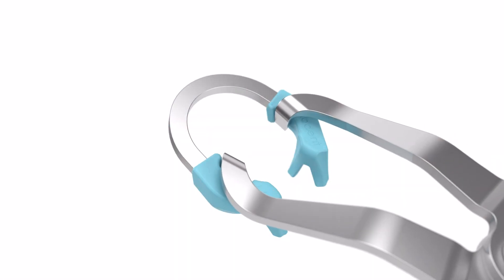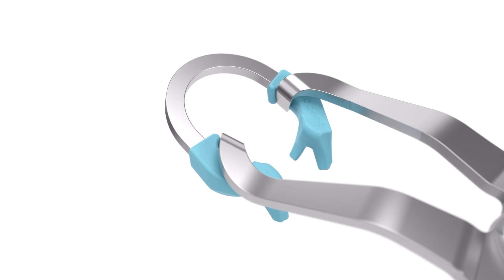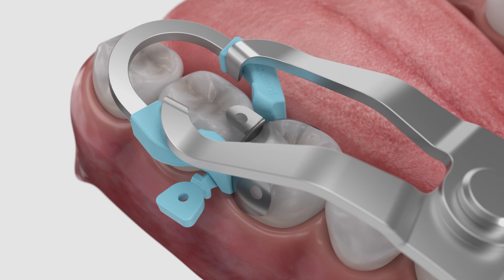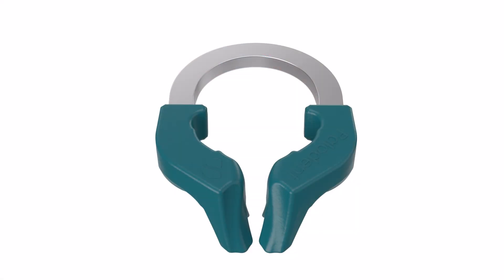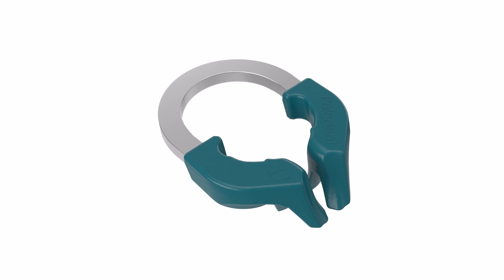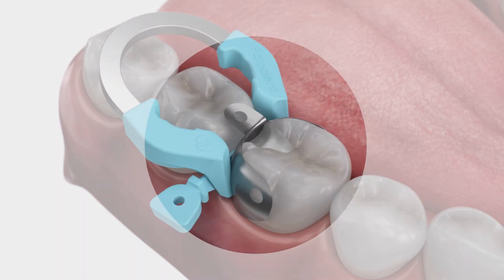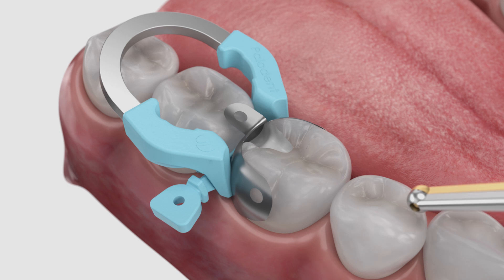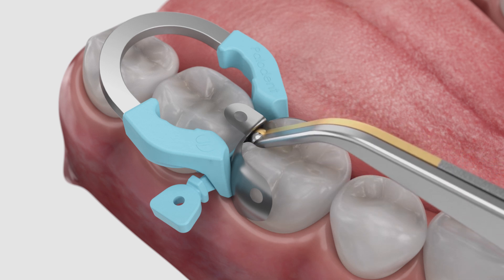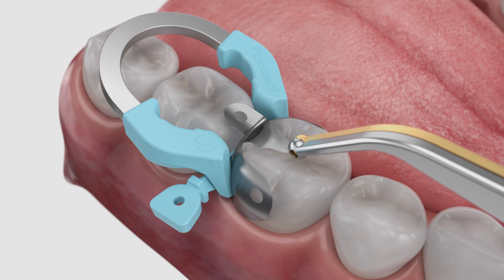After placement of the wedge, load the Palodent Plus ring in the forceps. Be sure the ring is fully seated as shown. If performing a restoration on a small tooth or premolar, you may prefer the Palodent Plus narrow ring. After placement of the ring, check the contact to the adjacent tooth. If needed, lightly burnish the matrix against the adjacent tooth. The pin tweezers have a built-in ball burnisher for this purpose.